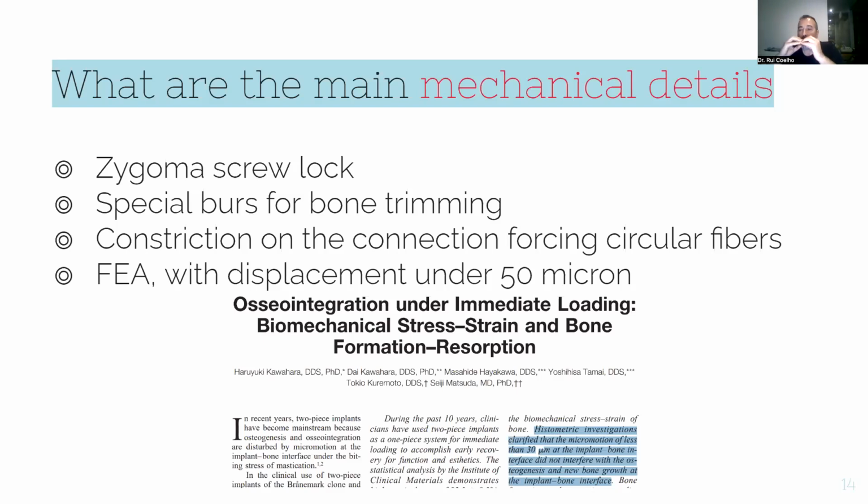And for us, it's always very important. Because we always do FEA, finite element analysis, for every case, okay? We always try to make the simulation so that the micro movement induced by the occlusal forces is always below 50 microns, okay?